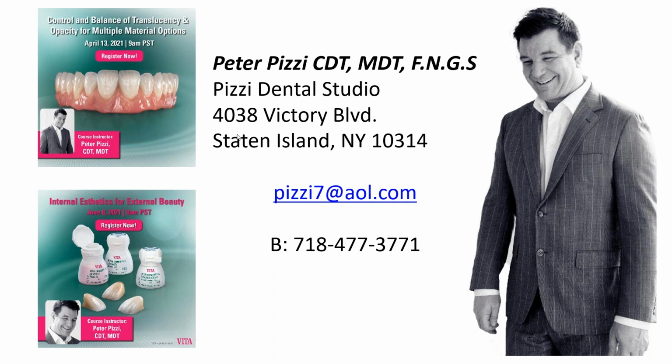So basically what Keon does in my office a lot of times, after the abutment is made and the crown is done, before we send the case out, we make a resin jig, kind of like a Maryland bridge that sits on the adjacent teeth and wraps itself around the abutment. That allows the doctor to unscrew the abutment from the cast, take it off, and place it in the mouth with the jig and torque it back down. It helps in a few ways.